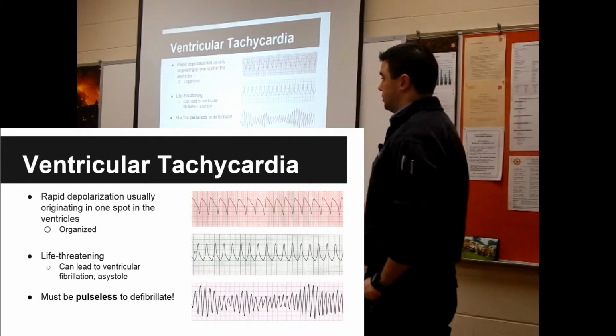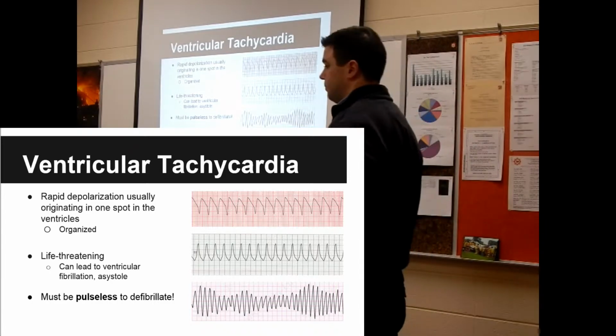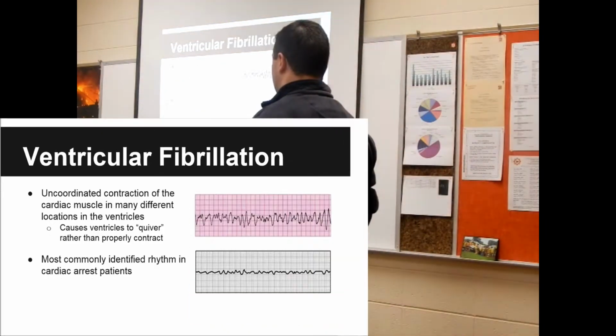If they have a pulse and they're in VTAC, Tyler discussed that. You're going to let the ALS partner take care of that.